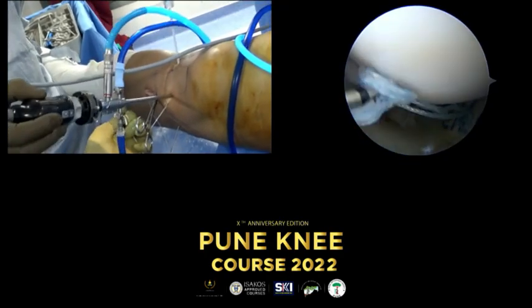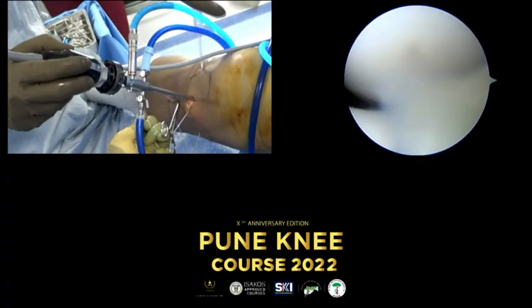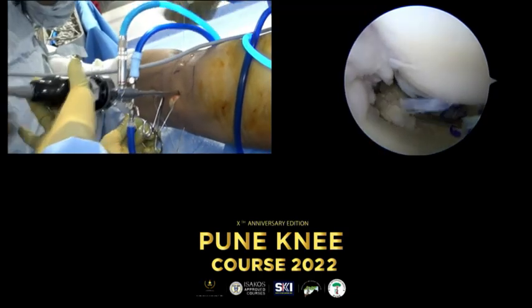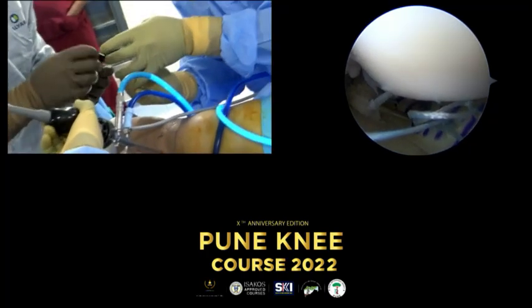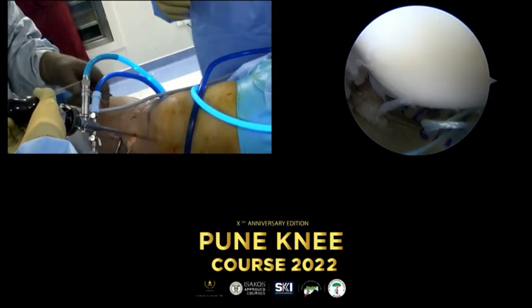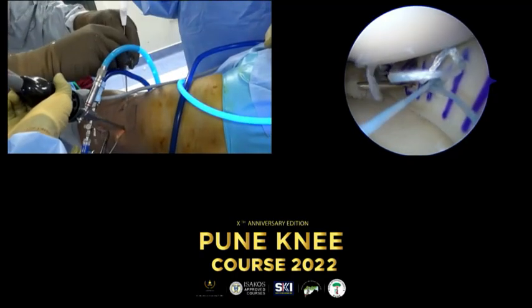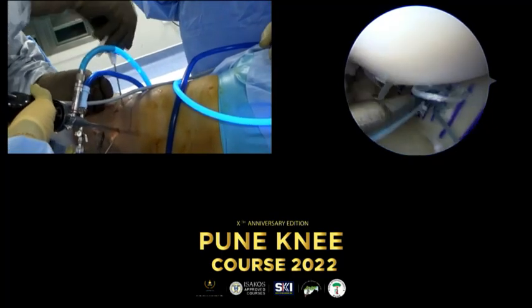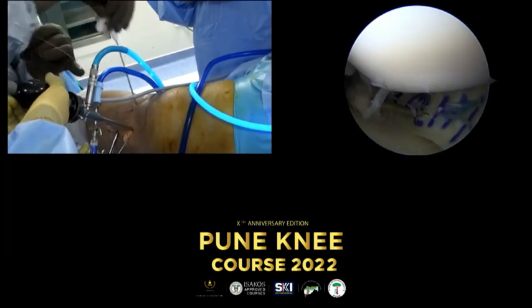I am. There we are. Okay, suture pusher. Wait, this is loose. Almost done. Doesn't slide, I don't know why. There we go. Okay. Now I'm much happier.